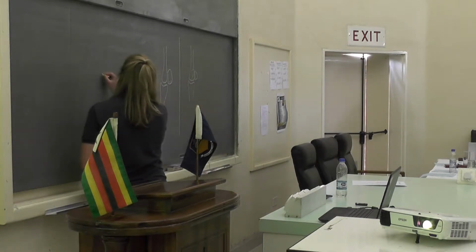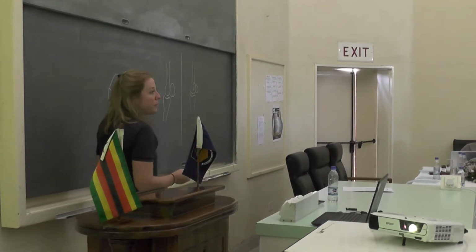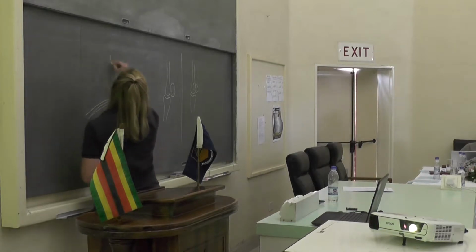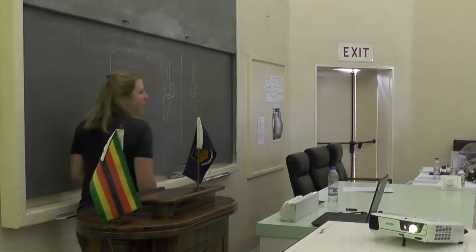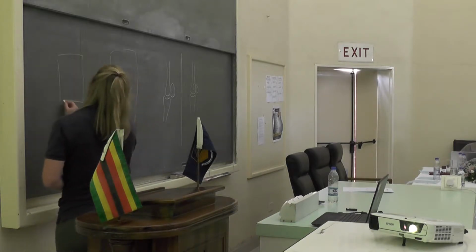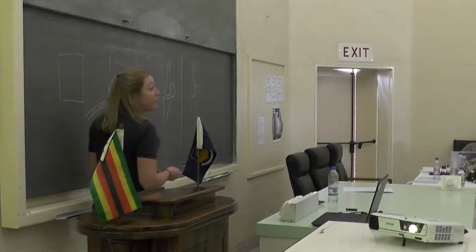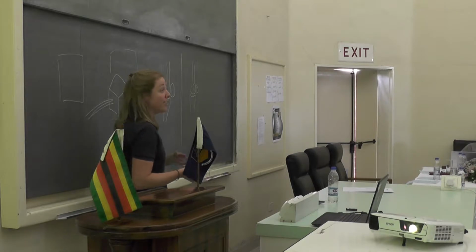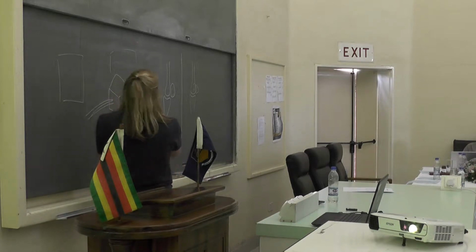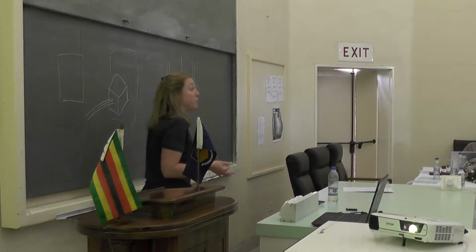So if you think of a cube, and you take an X-ray of this bit here, you have your cassette underneath it. How is this going to show up as a picture? You're essentially going to get a picture that is a square. And that doesn't give you nowhere near enough of an idea of what your structure actually has. There's going to be overimposition of all of this behind it, and that's why you need to change your positioning constantly to highlight different bits of what you want to image.